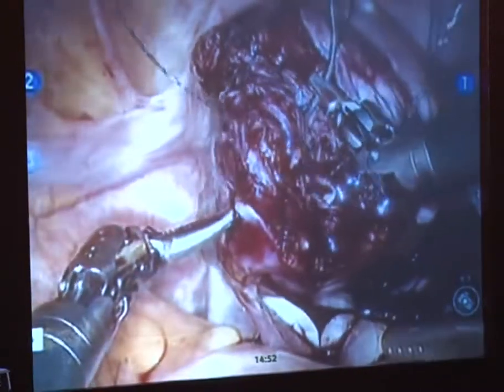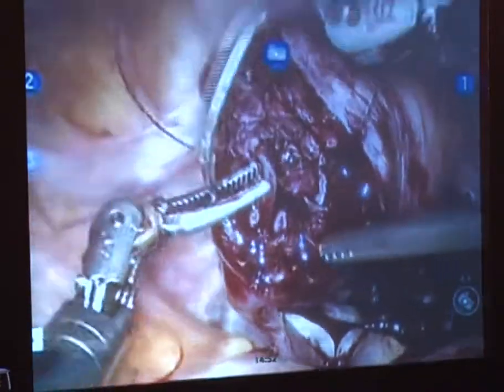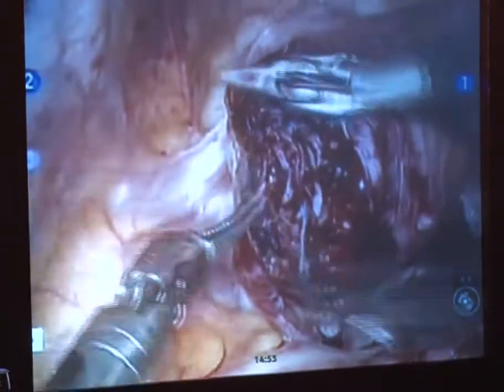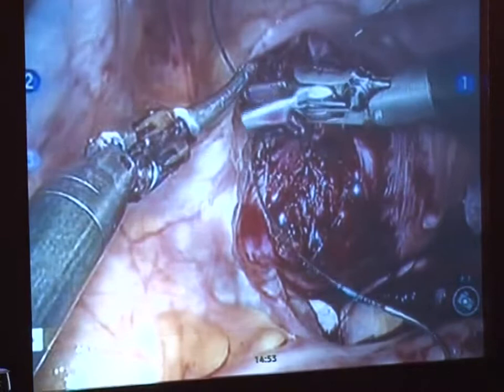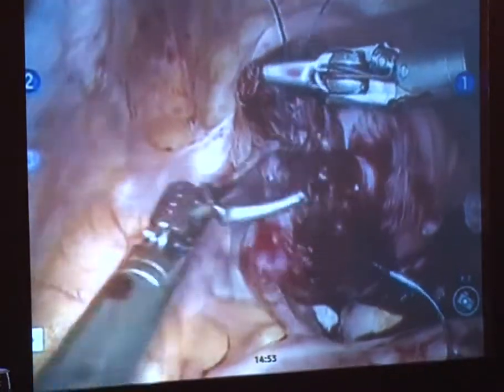So vertical incision is easier to suture, is it so? No. It's a much harder incision to close, just like it is in traditional laparoscopy. It's just the robot gives you a little bit more freedom of movement, but there still are some challenges when you go vertical. So you have to factor all that in.